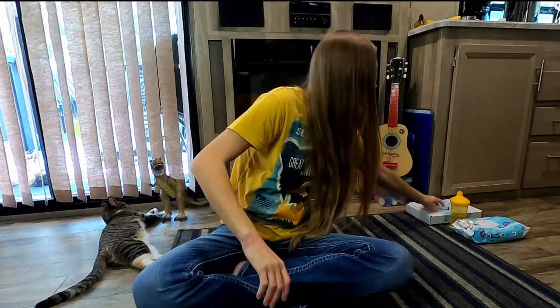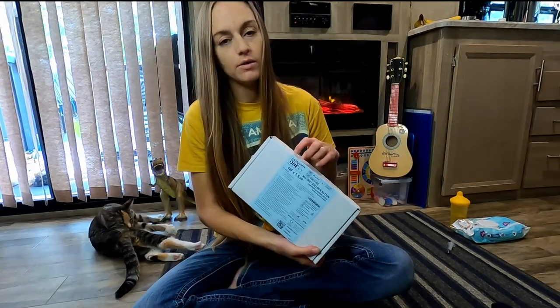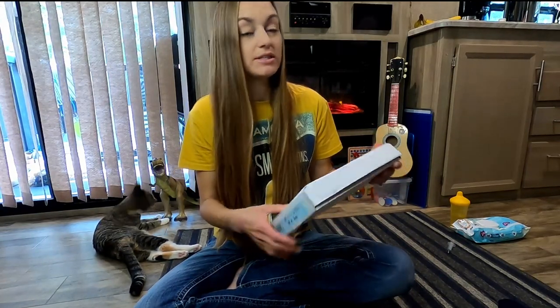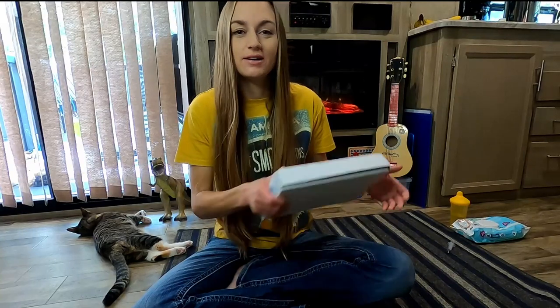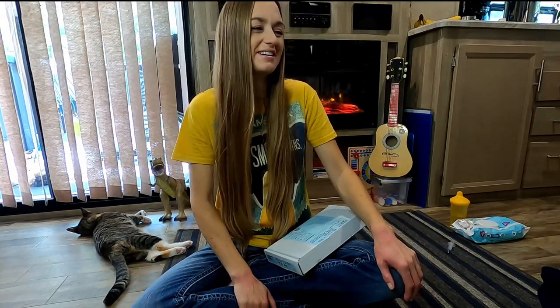Always carry an extra G-tube with you. They come like this. We get the mini one. We've always had the mini one. I really like it. We've never had a reason to change. Anyways, always carry one of these with you at all times, because you just never know when something's going to go wrong, the button's going to break. Always carry a spare. So right there in the back seat, he was in his car seat. I pulled out the spare that we had. I popped it back in, no issue. That was my first experience with changing a G-tube.